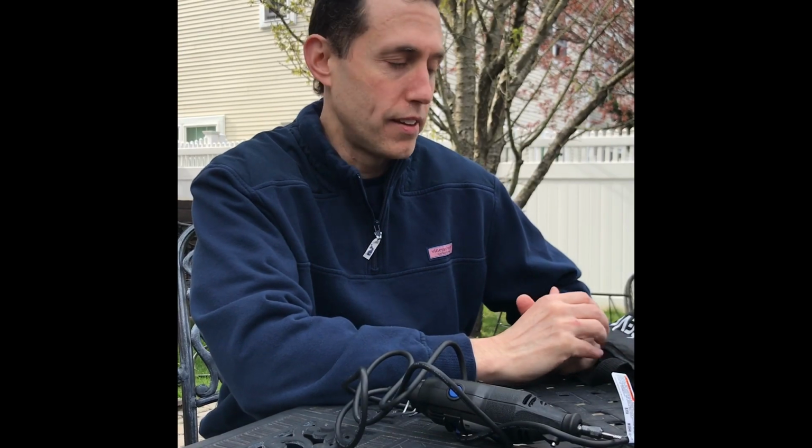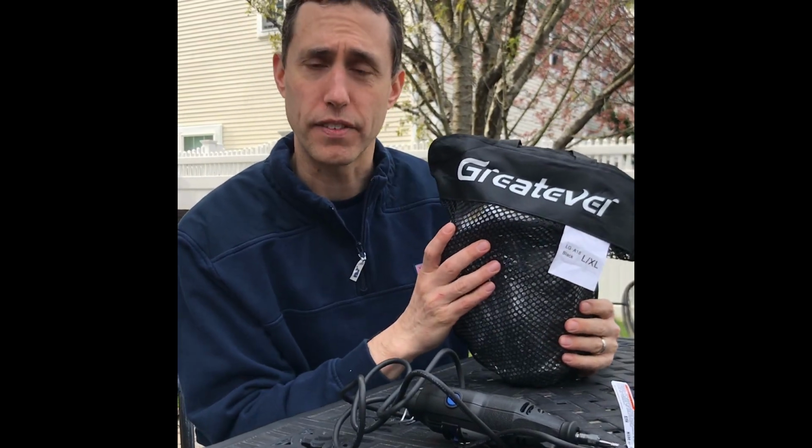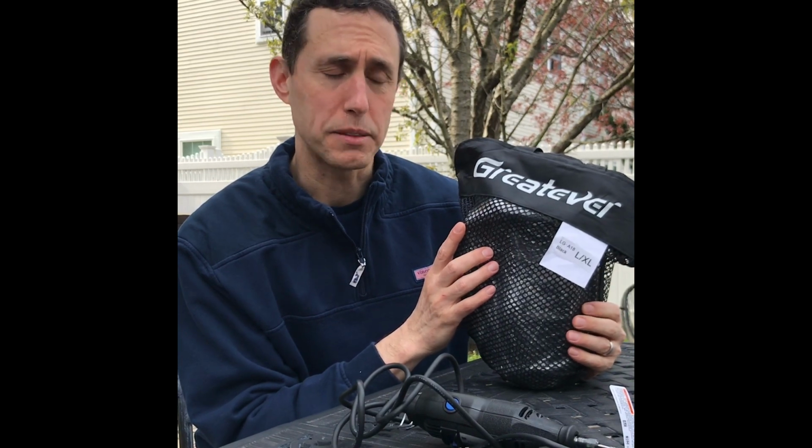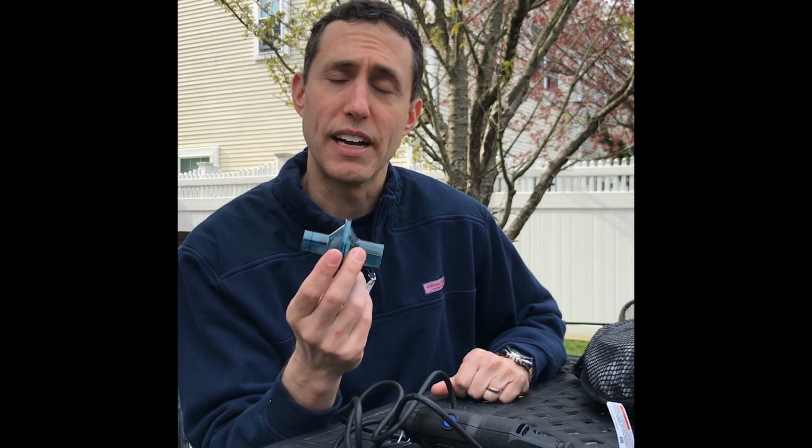To make the mask, first you'll need a full face snorkel mask that you can get from Amazon. There are a lot of different brands and colors available. Most people would take the larger size mask. I like the brand Greatever primarily because the snorkel is round and therefore accommodates the filter well. You'll also need a medical grade filter. This particular filter is the ViroMax filter by AM Systems. It's designed for ventilator circuits, and it's rated as 99.99% efficient at filtering viral particles.